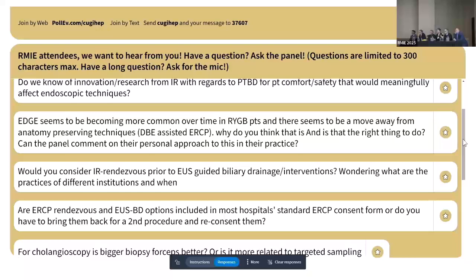But then when we come to this discussion on the other side, comparing ERCP and EUS-guided biliary drainage, EUS-guided biliary drainage is more like the surgical option. We are changing the anatomy. ERCP is the option that respects the anatomy of the bile duct and the pancreatic duct. EUS is like creating a new fistula. So I think it might come down to the same way as we say to a gastroenterologist who sees a large colon polyp and is not able to resect it.